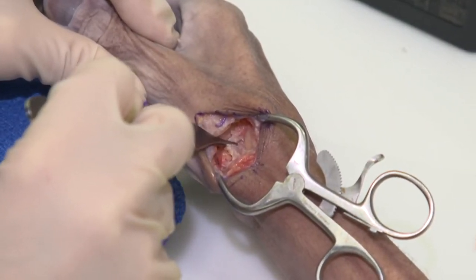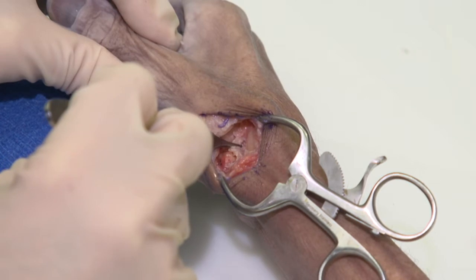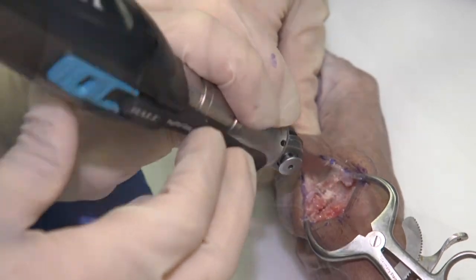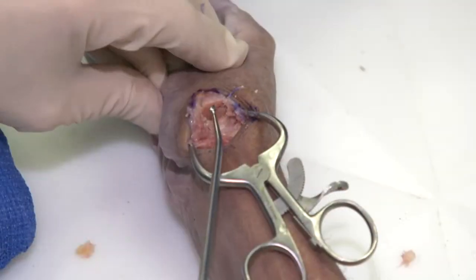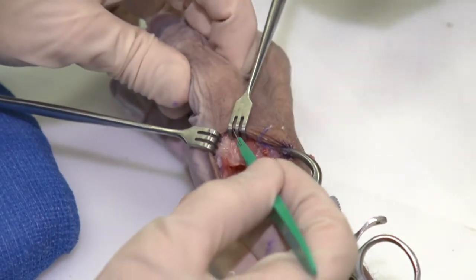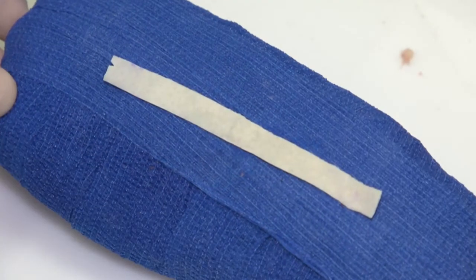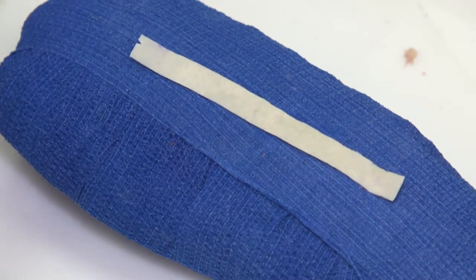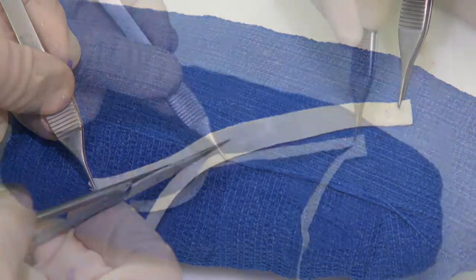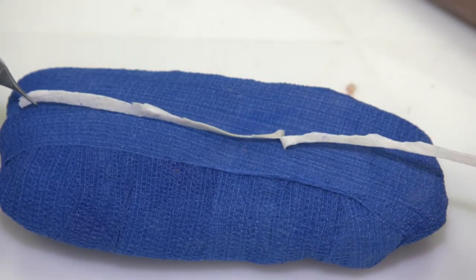If you were doing a traditional LRTI you would be using the FCR as your interposition, which we will not do in this case. I typically prepare the metacarpal — with use of the Hall Micro Free Sagittal Saw we will clean up the base of the metacarpal. Now with the curette I create my metacarpal hole, then drill into the lateral cortex of the metacarpal to pass the allograft tendon. We have our 1 by 12 Allopatch allograft and we'll split it to increase the length, giving us half a centimeter by approximately 24 centimeters, which makes it easier to pass through the hole.